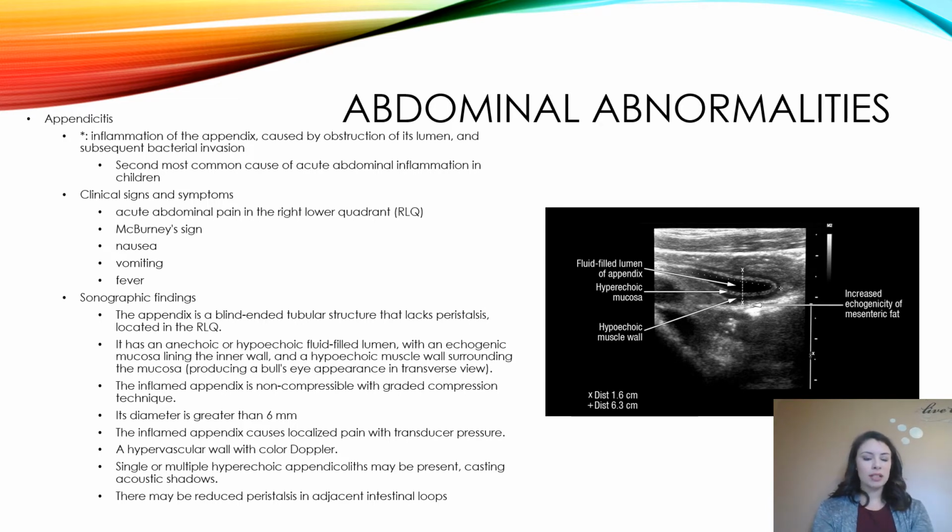The inflamed appendix is non-compressible. The diameter is greater than 6 millimeters. The inflamed appendix causes local pain when the transducer is over it. There's a hypervascular wall with color Doppler. There could be appendicoliths casting some shadows, and there may be a reduced peristalsis in the adjacent intestinal loop.